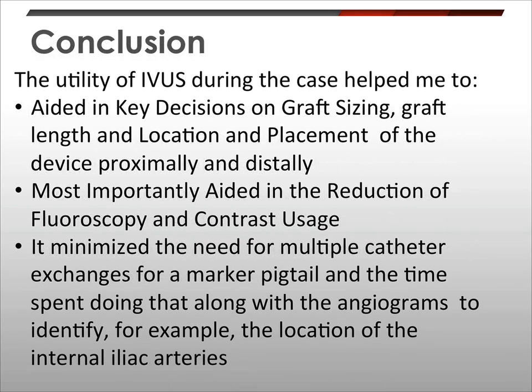In the final slide, it also aids in my key decision making on graft sizing, graft length, and the location and placement of my main body and iliac limbs. Most importantly, it helped me reduce fluoroscopy time significantly, and I use minimal contrast, typically only doing runs around the time of the original graft placement at the renal arteries and the final run to rule out endoleaks.